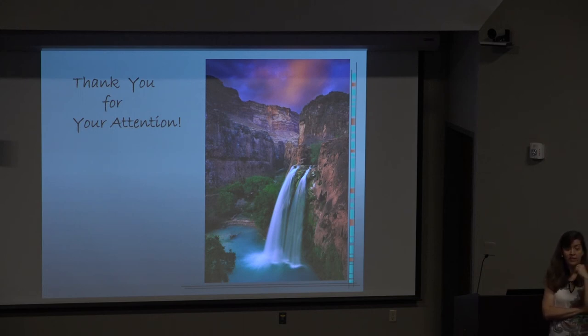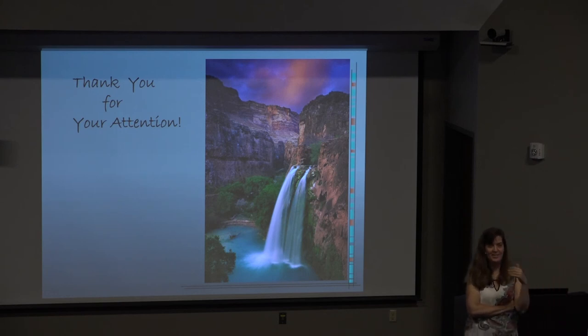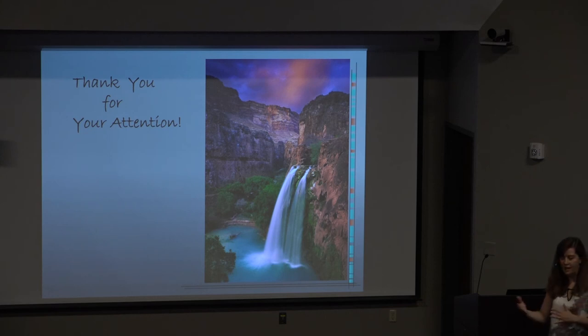We have been learning with you over the years on this topic, because it isn't something that we see a whole lot of. We do get some feedback and we look at pathology, but we don't do very many of these a year. From my experience, the farther along in pregnancy, the placenta gets very heterogeneous and very lobular.